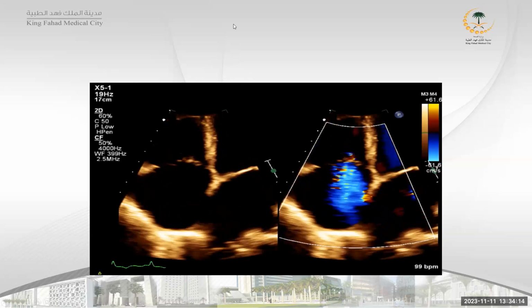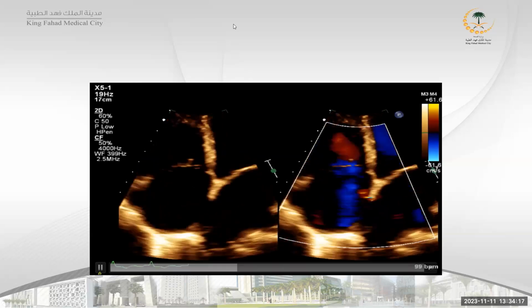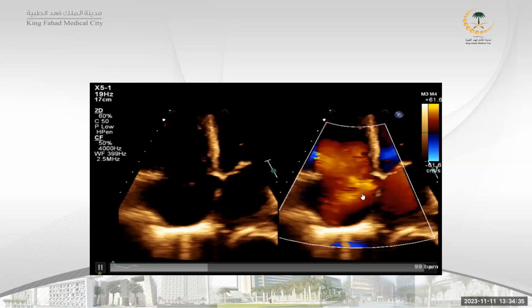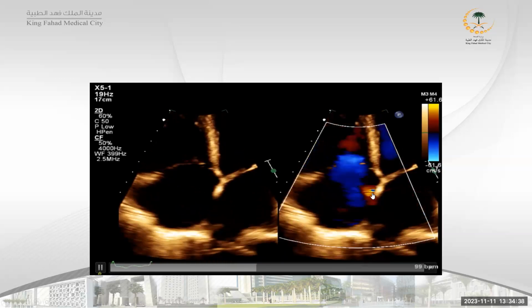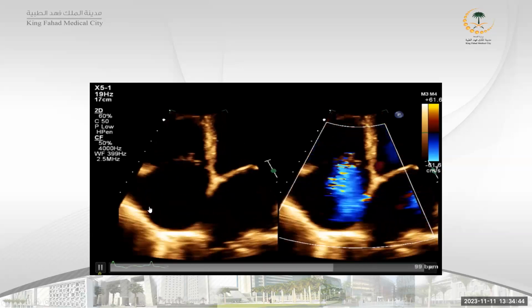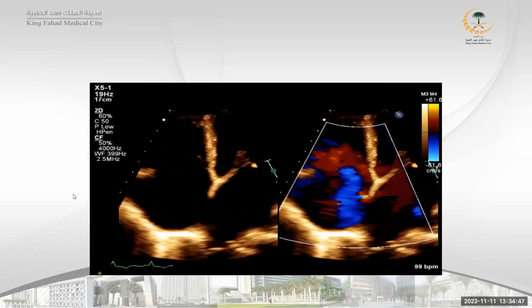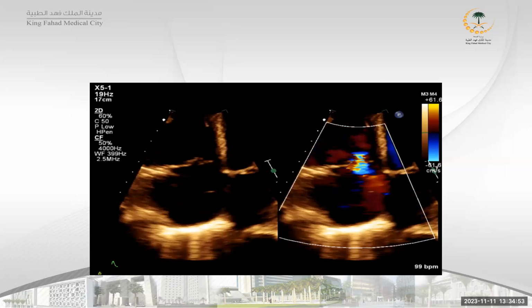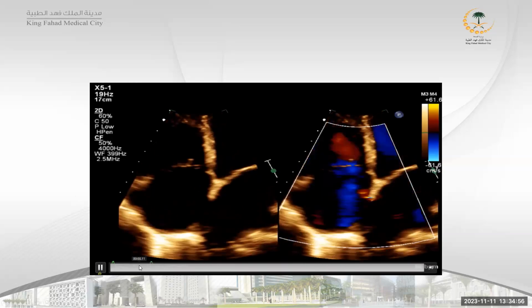Let's see the chat. ASD, tricuspid regurgitation, RV, ASD secundum, moderate to severe TR, large RA. Okay, you are right, but we have another finding. Just concentrate. So you have here a shunt, that's right, this is left to right. If you write secundum ASD or patent foramen ovale, you are correct. You have likely at least moderate TR, moderate to severe. We have a dilated RA. What else? They may bring one common finding in the exam. It is there. Anybody can notice?